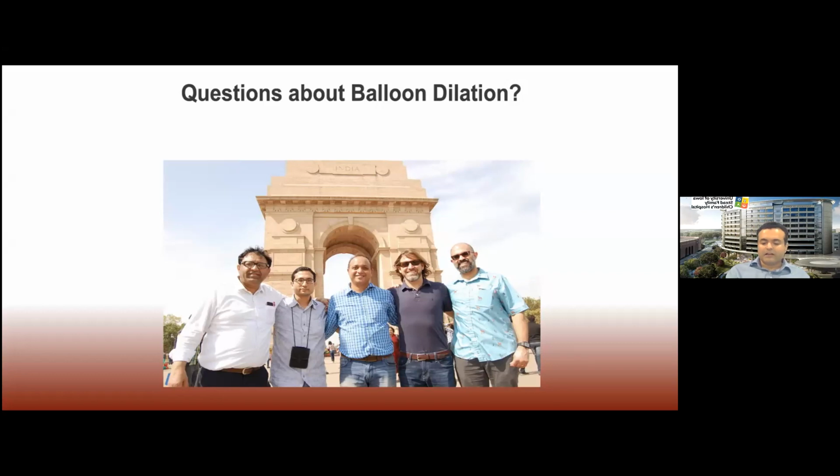And the last thing is, I usually prefer to inject Kenalog first if that makes any difference. One of the reasons is, if you end up creating a bleb with the Kenalog, with the balloon, you essentially help to spread that whole Kenalog evenly. So I inject Kenalog first and then do a balloon dilation.